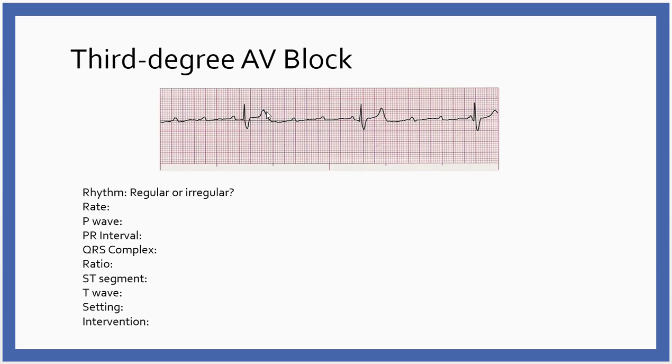And then move your ruler down so you leave your first mark here, your second mark will be here, and move it down so your P waves are consistent. Yeah, there's a P wave on top of this T wave here, with the T wave, P wave, P wave, P wave, and probably once again a P wave up here. So, complete heart block in that the SA node is continuing to fire at a regular interval.